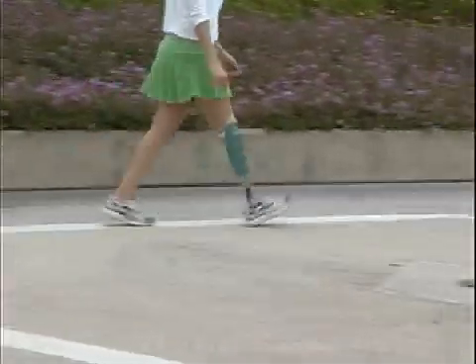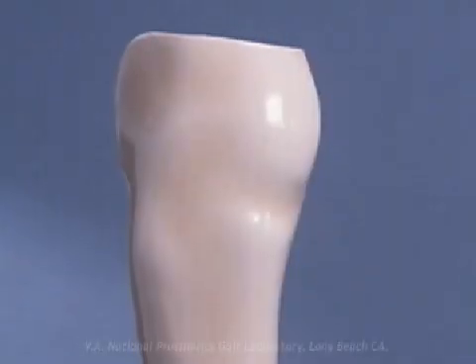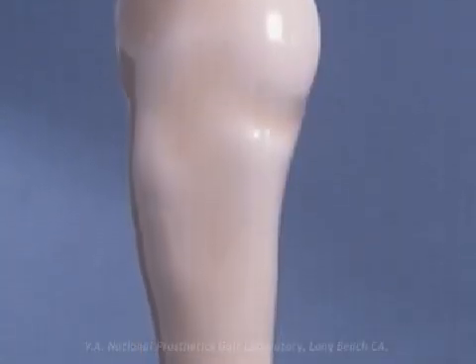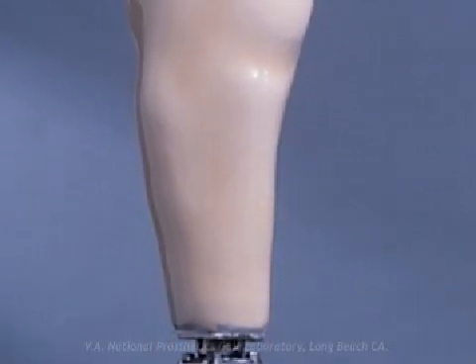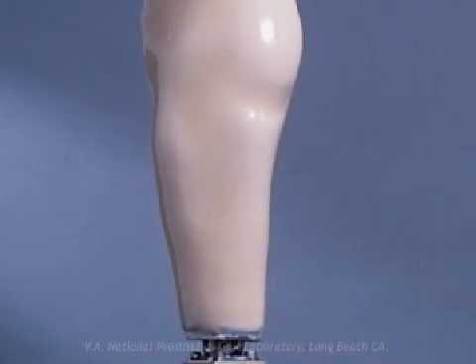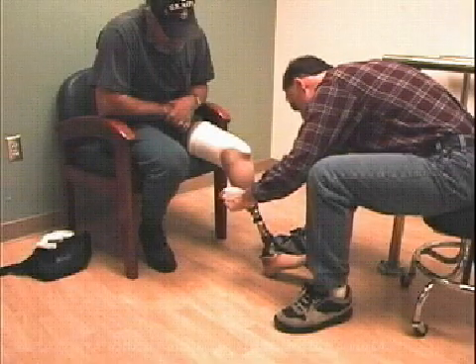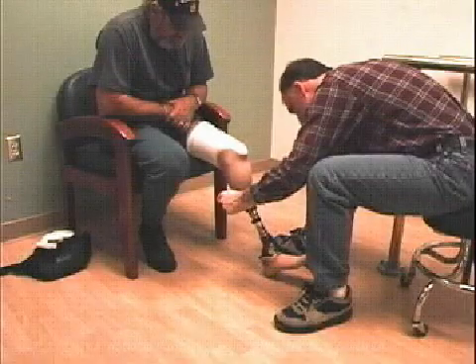Ensuring appropriate knee flexion in a transtibial amputee is one of the most challenging aspects of the dynamic alignment process. Static alignment often makes use of the subcutaneous crest of the tibia, or tibial blade, to establish alignment of the residual limb within the prosthesis. The socket is set so that the tibia is tilted slightly forward to avoid a backward thrust during stance.